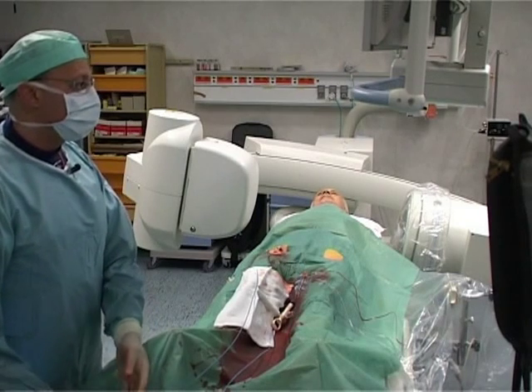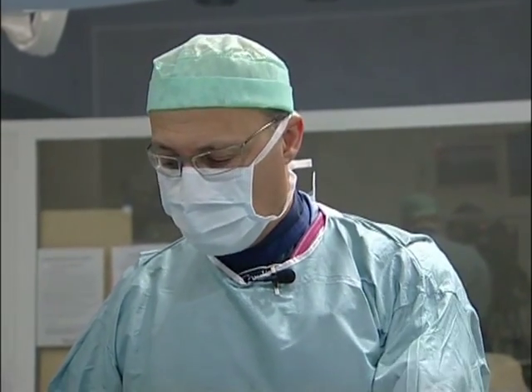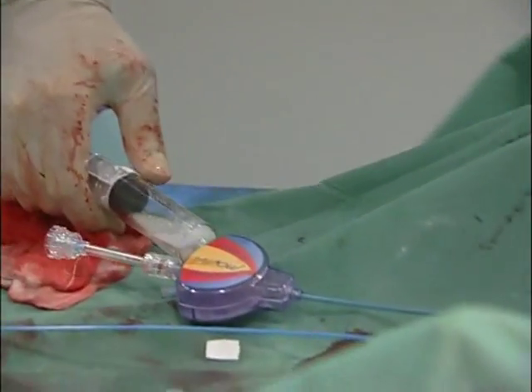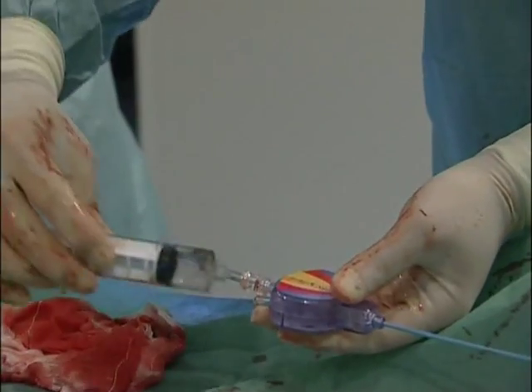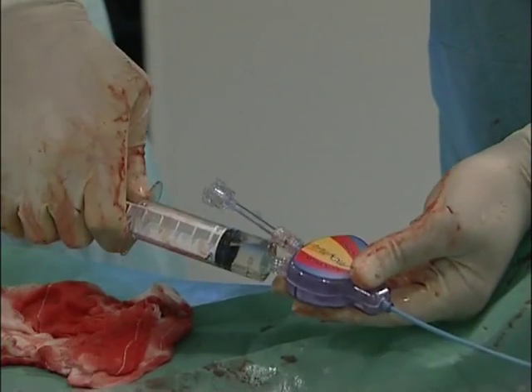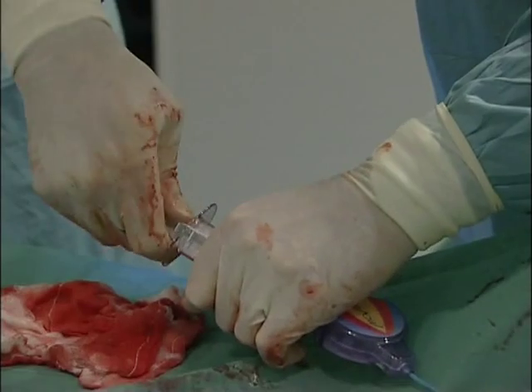So here in this patient, we are going to use a proximal occlusion protection system with the MoMA protection device. We start by preparing the external carotid balloon for the external carotid artery. We'll aspirate for about 10 seconds. We do the same thing on the balloon of the common carotid. We aspirate and we hold for 10 seconds to ensure that there's no bubble.